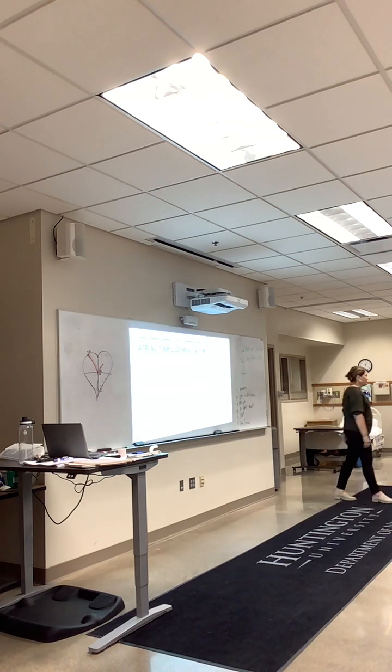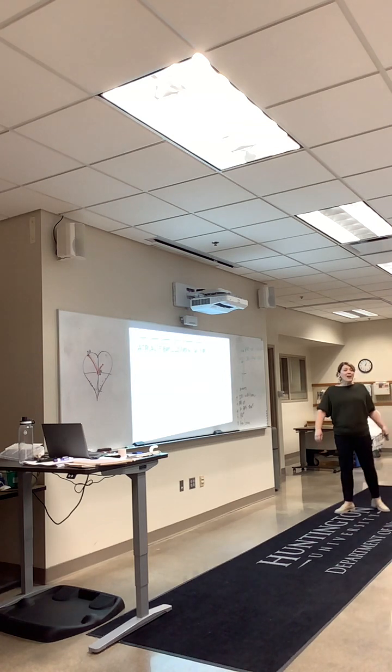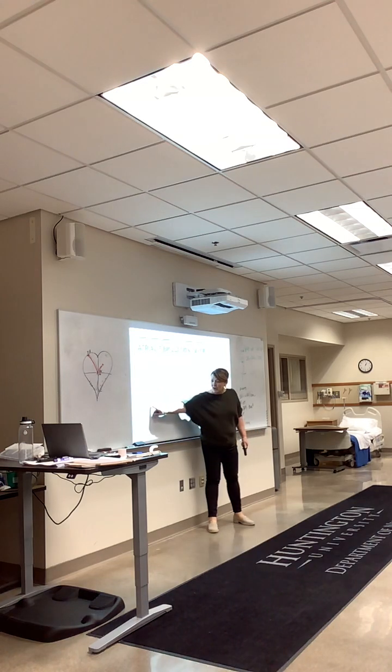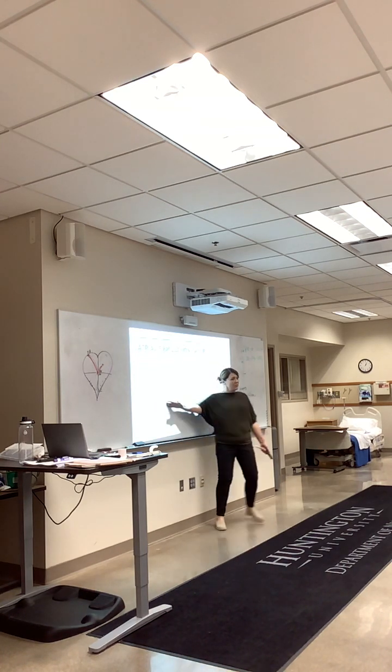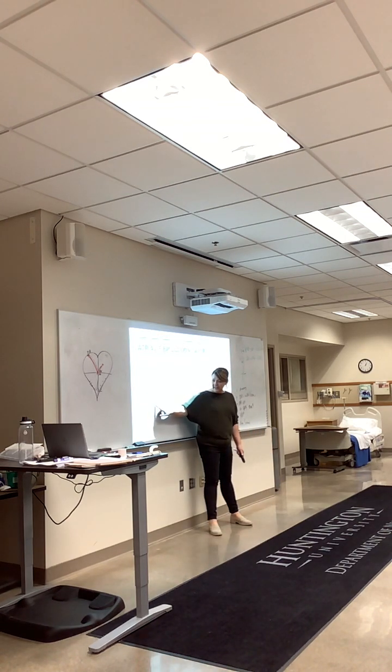Do I have a P wave? That's exactly right. This whole wiggly line here, these are all different P waves. No, I'm not going to make you count them. There's probably 30 along here, to give you a rate of about 300. So these are all little P waves. It has multiple P waves, but I do have P waves. Does it have a QRS? Mm-hmm. Is my QRS narrow or wide?